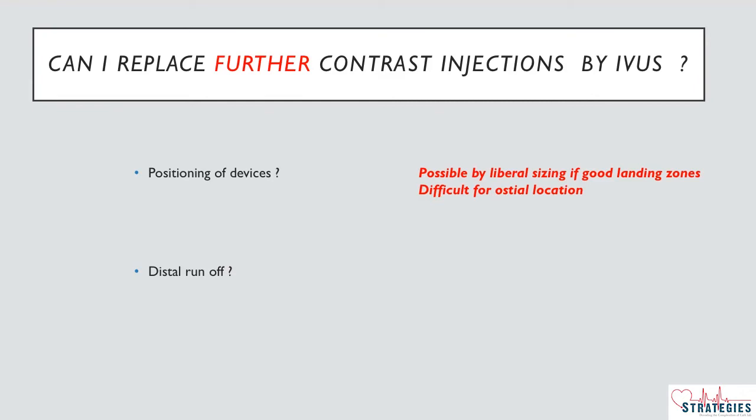If the speckling is increased, that clearly says your distal flow is slow. But the operator should be very cognizant of the speckling pattern in the first image and the image he is doing. With that you can understand.